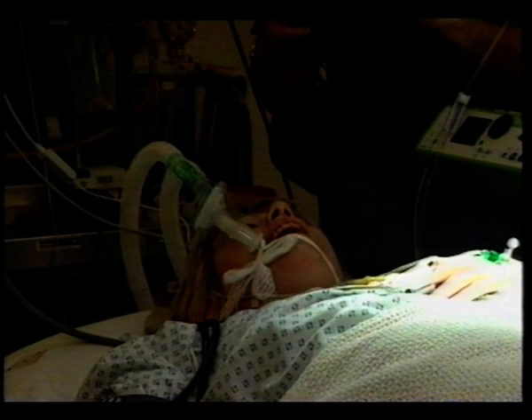One can, of course, talk directly to the patient at any time before the headphones are placed. There may be strong reflex movements of the hand and forearm at this point. If this occurs, it should be checked that the patient isn't conscious and reacting to intubation by asking the patient to squeeze their hand in response to command, rather than as a spontaneous reflex as in the unconscious patient. If necessary, give more induction agent, but do not release the pneumatic tourniquet.